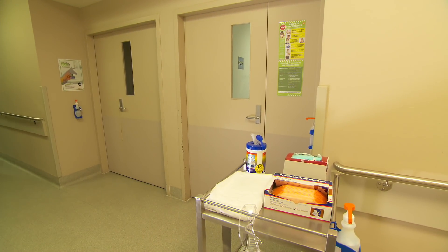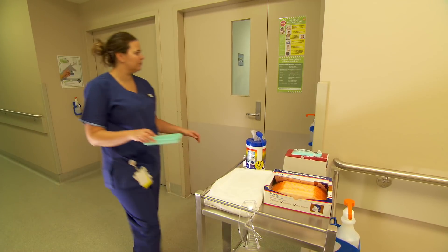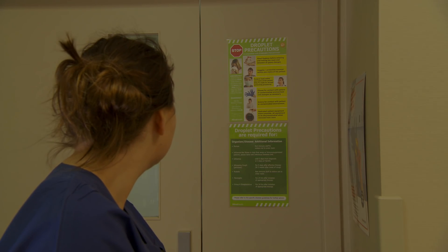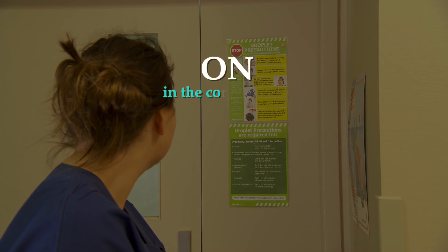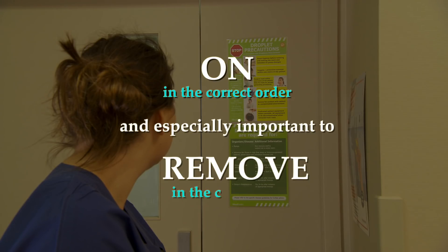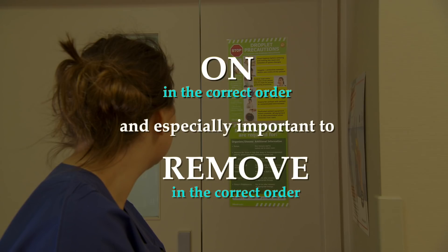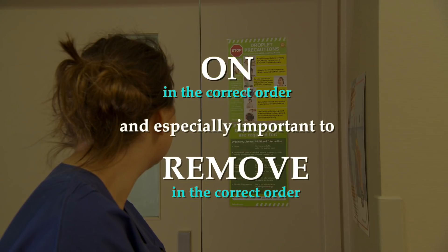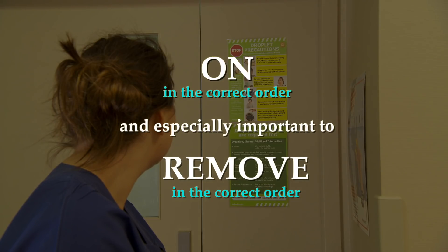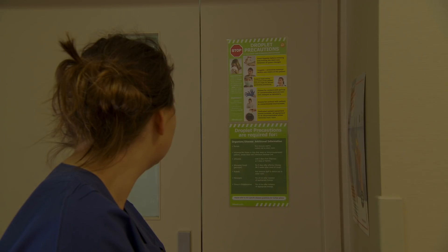Tenille arrives outside John's room and notes the specific isolation signage. It is important to put the PPE on in the correct order, and especially important to remove it in the correct order, so that you reduce the risk of contaminating oneself, your colleagues, other patients, and the clinical environment.